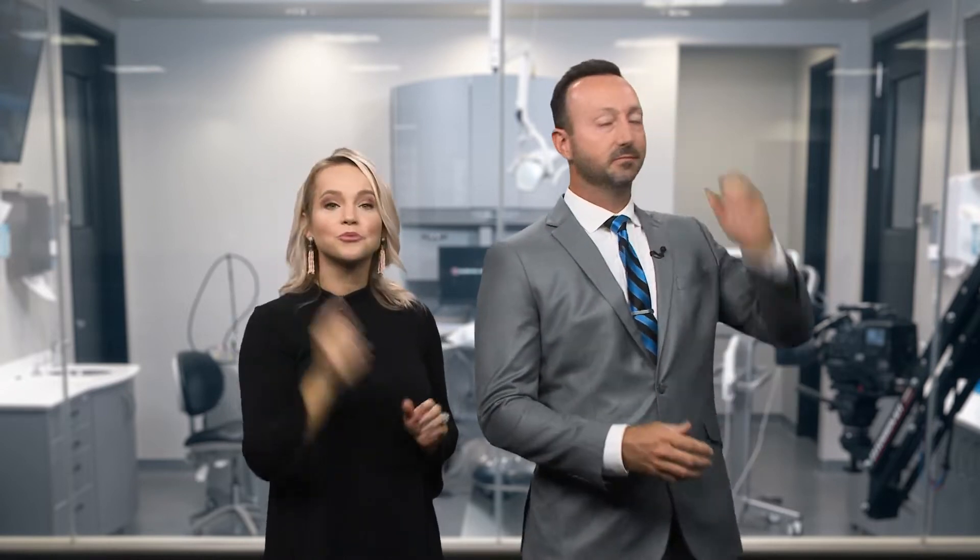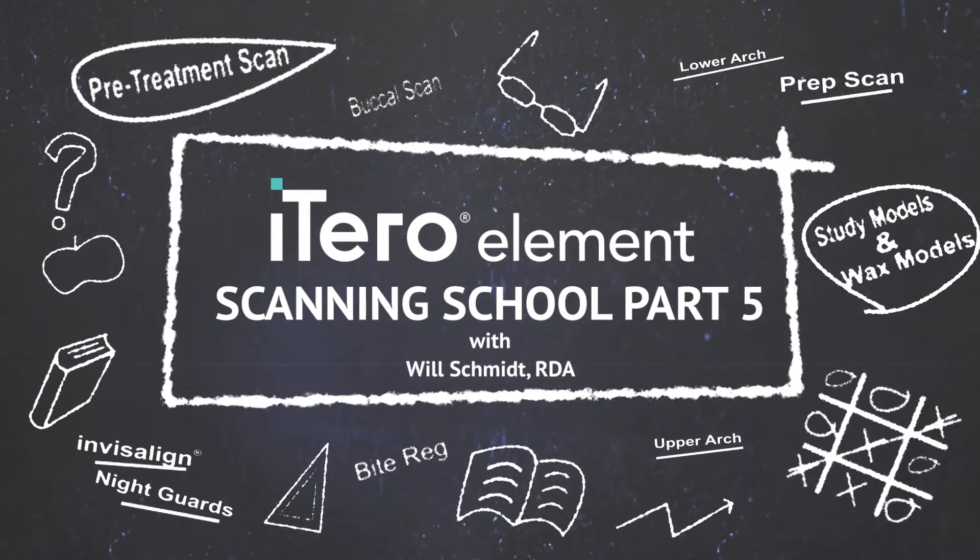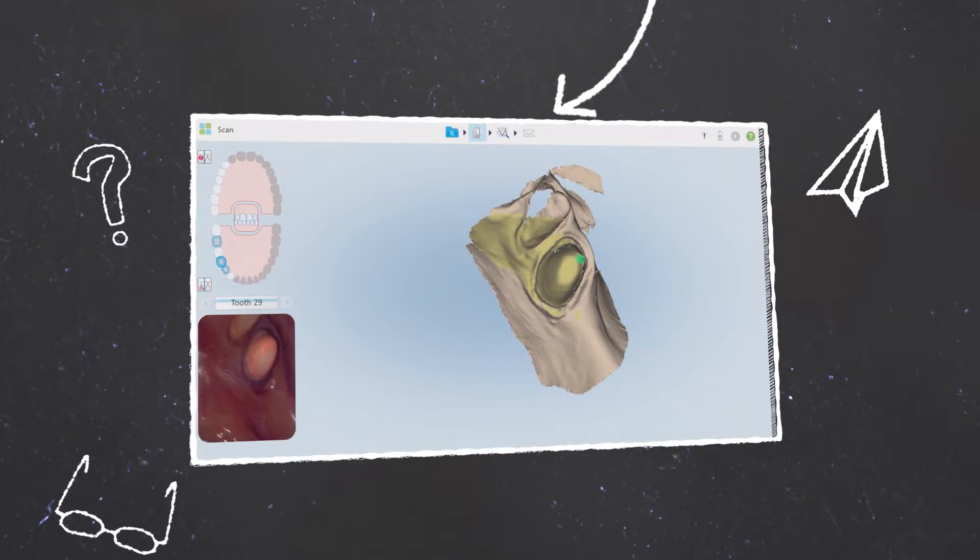We've got a three-unit bridge adjacent to a single crown. I'm going to teach you how to chart this, how to link the bridge together, how to set it all up, scan it, and send it to the lab for fabrication. Scan school is back in session. This episode is going to take you another step further into rounding out your scanning skill set.